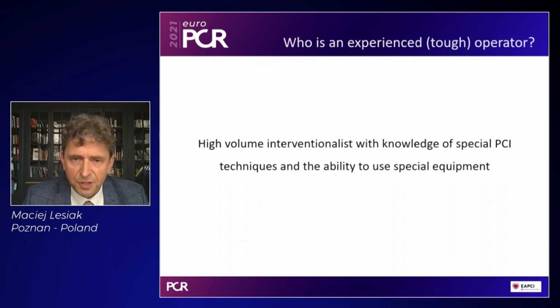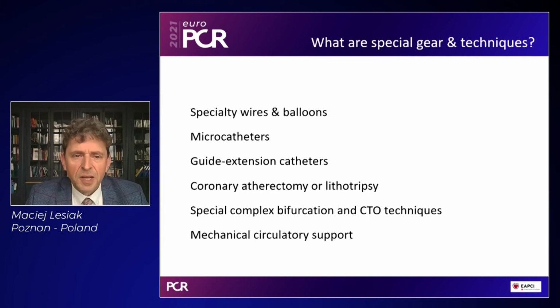So who is an experienced, or I call it tough, operator? I think that's the high volume interventionalist with knowledge of special PCI techniques, and what is very important, the ability to use special equipment. What is special equipment? We all know the specialty wires and balloons, the microcatheters, the guide extension catheters, coronary atherectomy or lithotripsy devices, some special complex bifurcation and CTO techniques, as well as mechanical circulatory support.